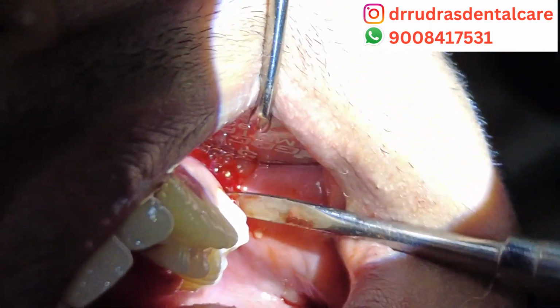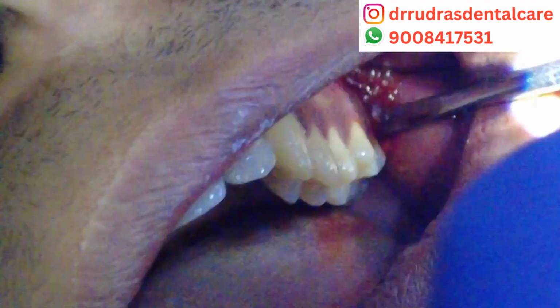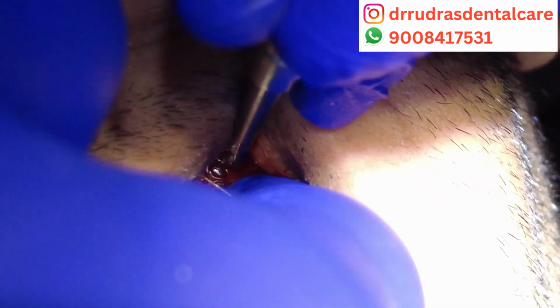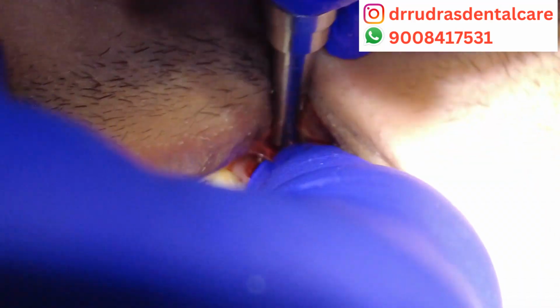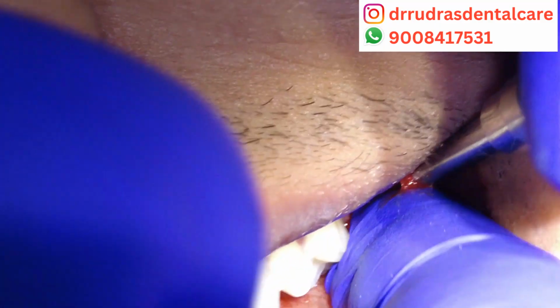And now we have started luxating the tooth. We've placed the elevator between the two teeth, and now we are using principles of oral surgery exodontia, where we are very carefully but with calculated force, direction and angulation, trying to shimmy the tooth out. The patient is not feeling any pain right now, only pressure, and we were speaking to the patient while we were doing the procedure to ask if he is feeling any sort of pain, and the patient said no.